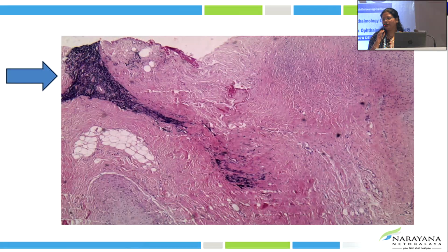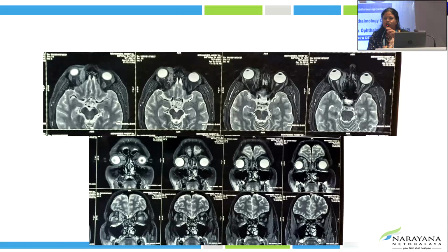So this was the biopsy for us, and with my experience, I know that yes, this is not a representative biopsy. I'm fortunate enough to be in an institute where we have EMR access. So I just go look up the images. There's quite a large mass there. So I know that this is not a representative biopsy.